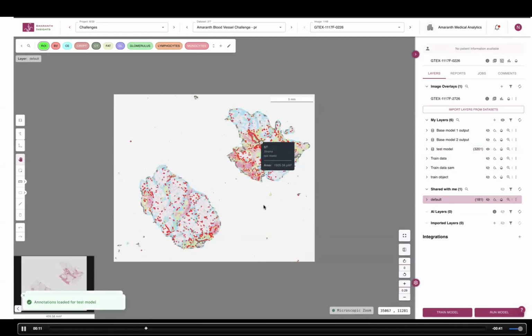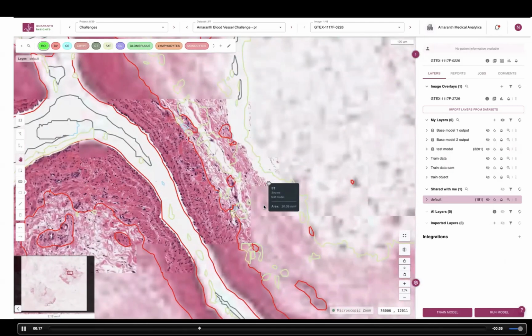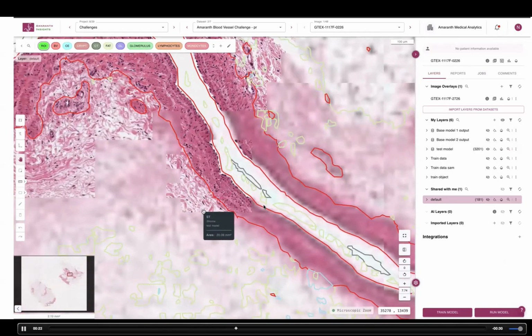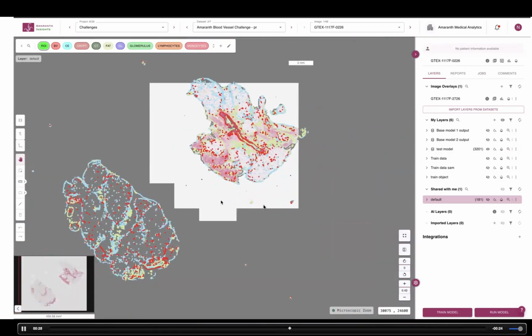Of course, this was just an example with just one image and very little training. It's been able to identify this on this specific image. Likelihood of this working on other images is very low because we just used one image to do the training.